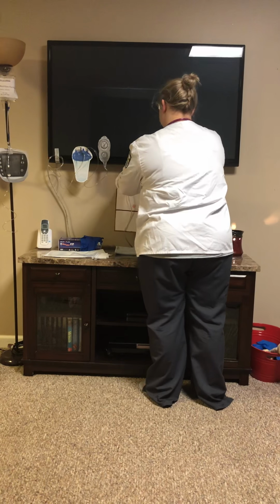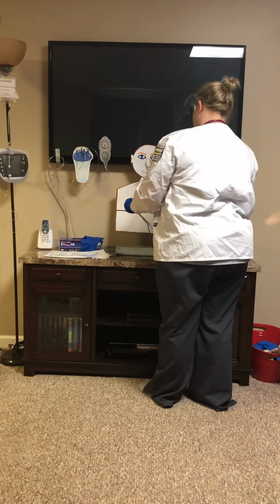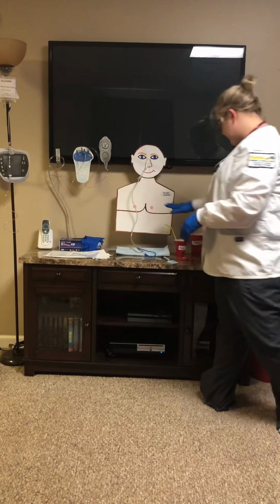I would remove the temporary tape to prevent skin breakdown. I would measure the tube with a permanent marker, and I would clip the tube to his gown.